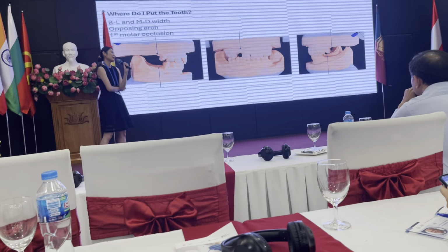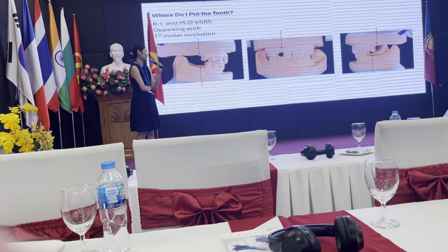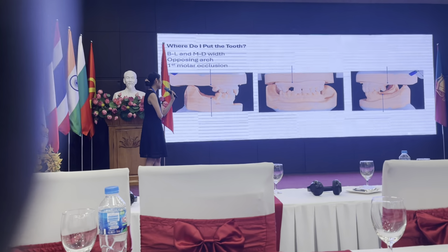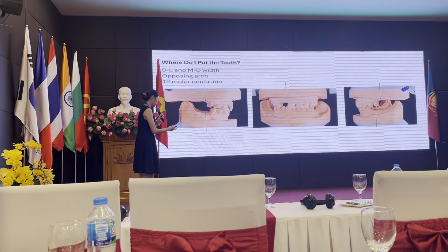If you have a single tooth, it's not too difficult to estimate the mesiodistal dimension and do the implant placement here. What about if your patients have multiple missing teeth?